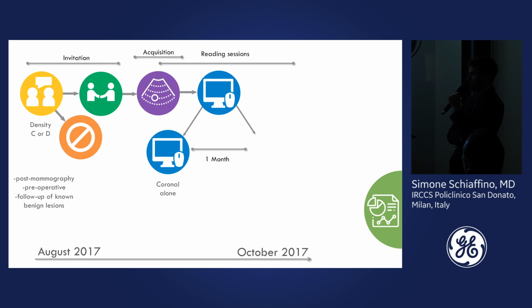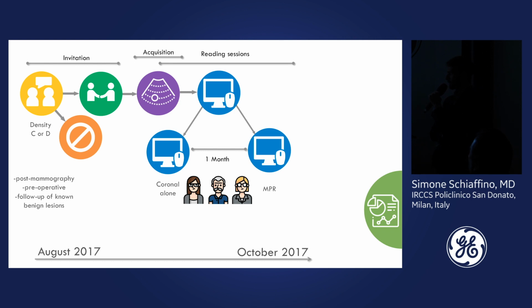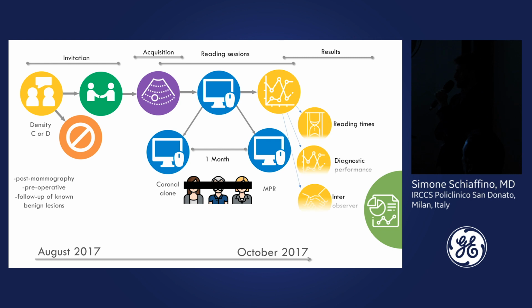Three different readers performed the reading session, with 5 to 25 years of experience in breast radiology, and they were blinded to the clinical and radiological data of the patients. We obtained results in terms of reading times, comparing the first and the second session, and diagnostic performance of the coronal plane and the multiplanar views, considering histology as the reference standard when available, and, when not available for benign lesions, at least 2 years of negative follow-up.